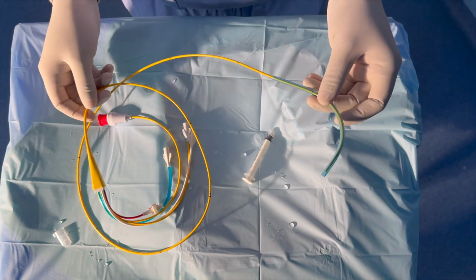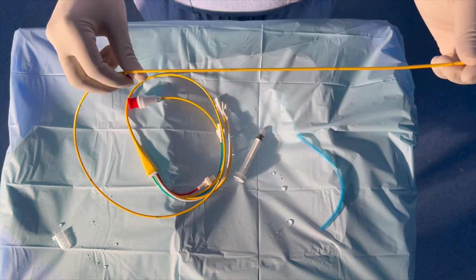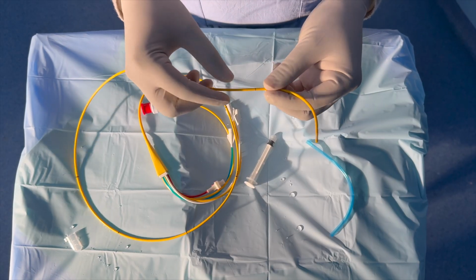This PA catheter has 110 centimeter length and is 7 French for adult size. This PA catheter has a few markings.